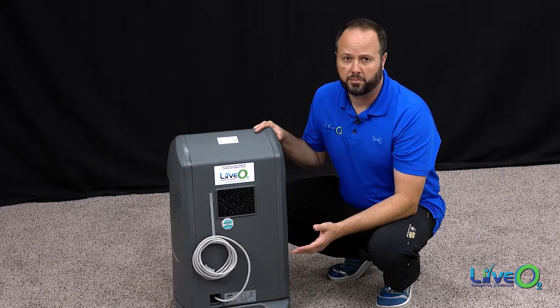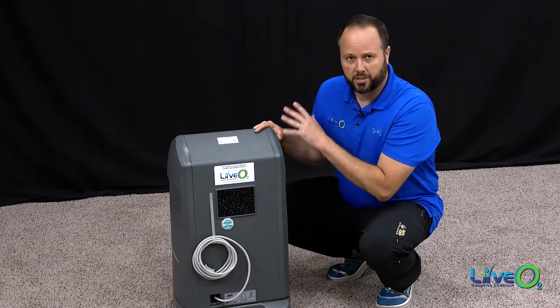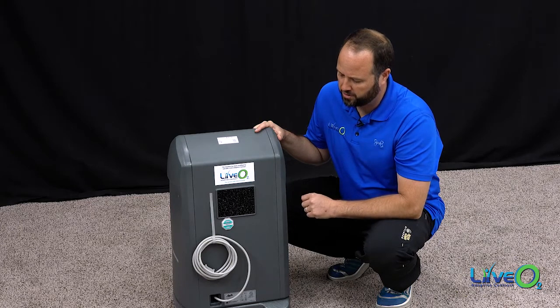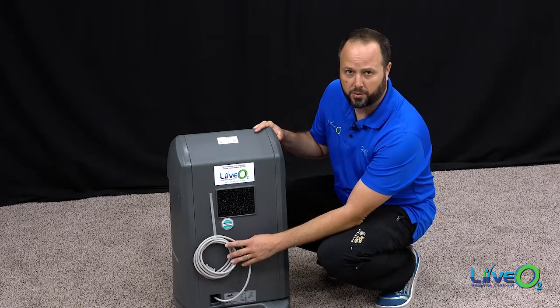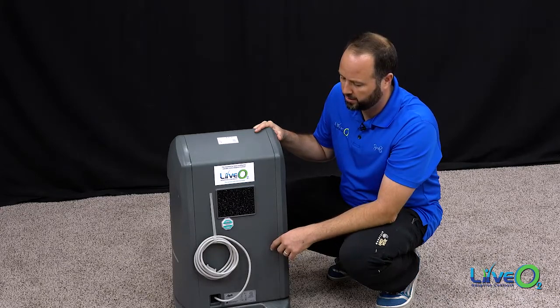There are a couple of items we want to point out before you go into actually setting up your system. When we look at the back of the air separator, we see four things we want you to know about. The first is the power cord. We'll unbind that and can eventually plug it into the wall when we're ready to go.